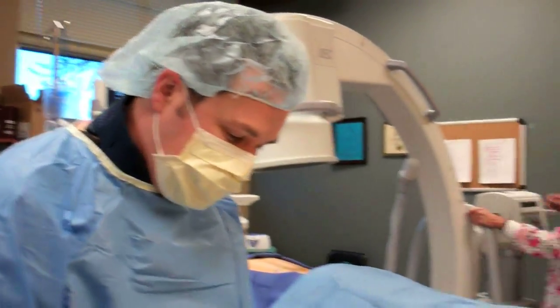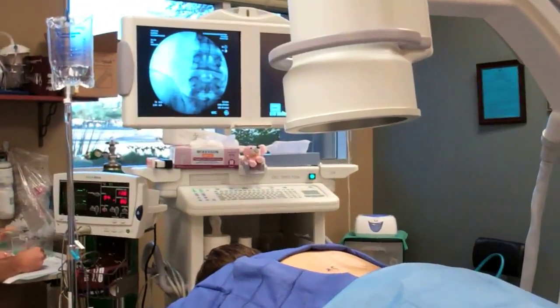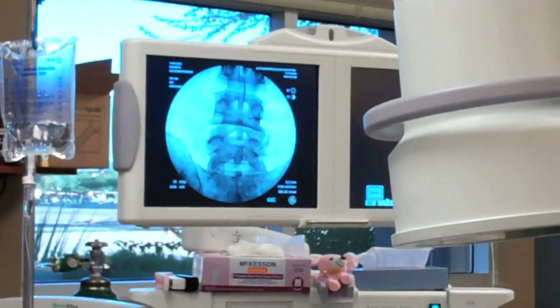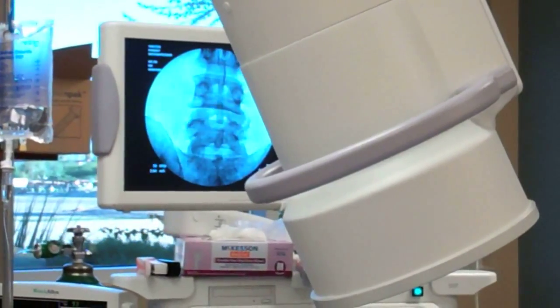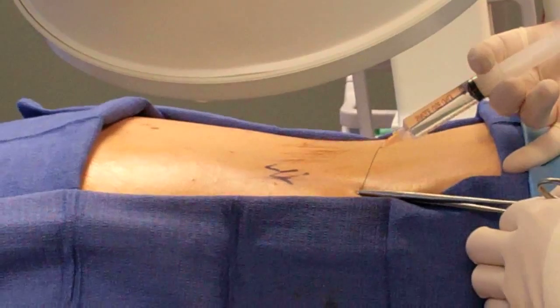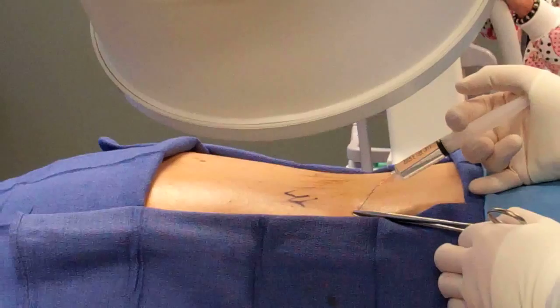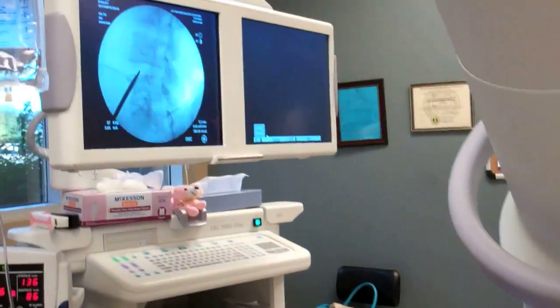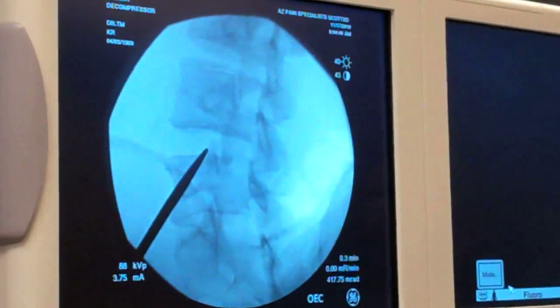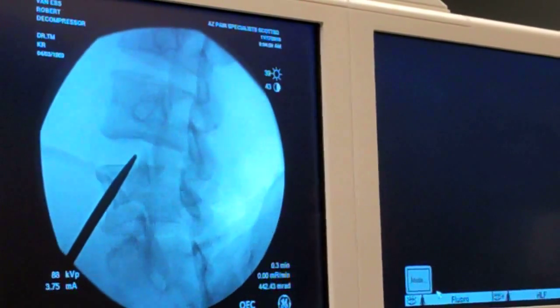We'll get started here. First thing I'm going to do is just numb up the skin. We're going into the L4-5 area. His pain is on the left side and there is some irritation along the adjacent nerve right there at the L4 nerve. You're going to feel a little sting and burn here — I'm going to numb it up really well for you. And that looks about where we want to enter, just lateral to that superarticular process there.